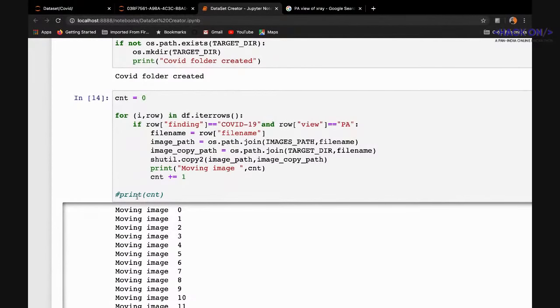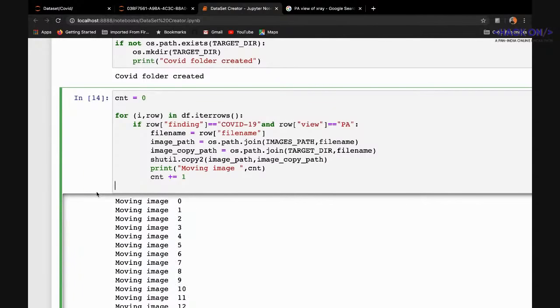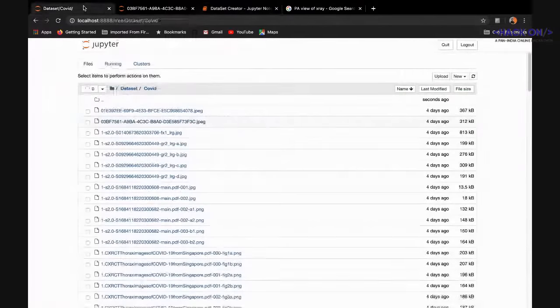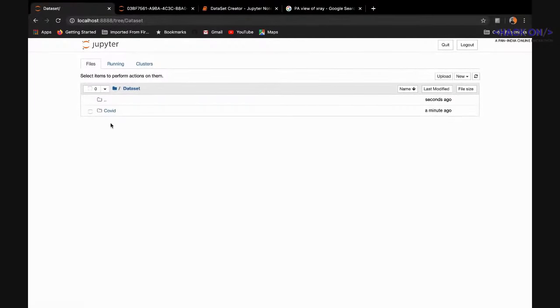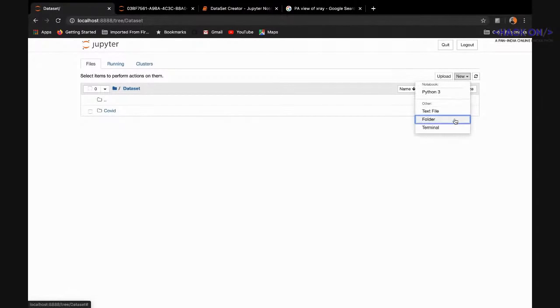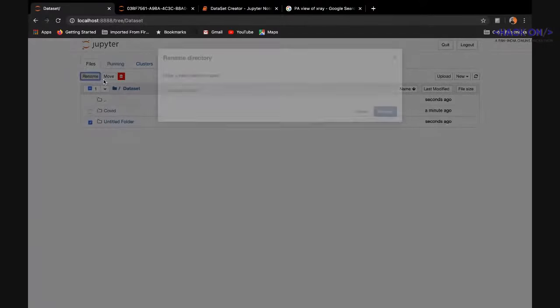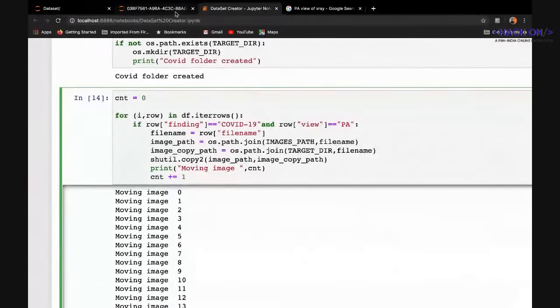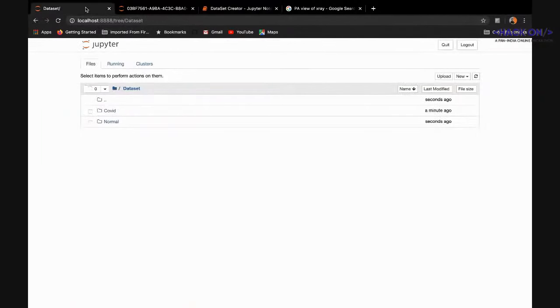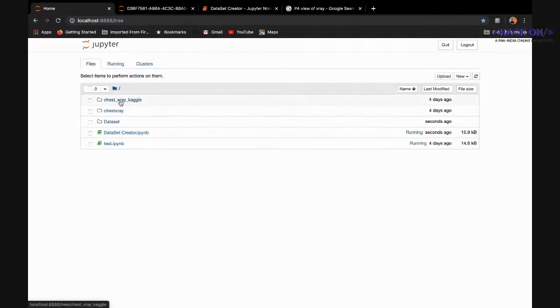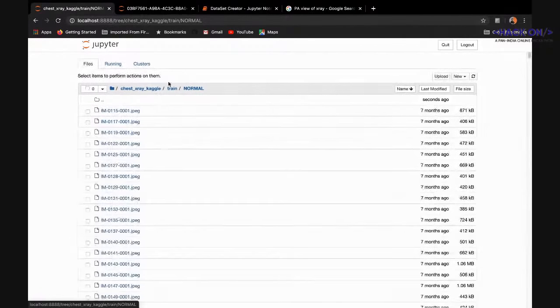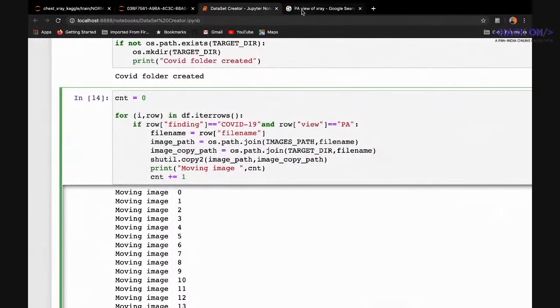Now we need to create a 'normal' folder. We'll create another folder containing normal images using the Kaggle chest X-ray dataset. In the training part of that dataset there are two folders: 'normal' and 'pneumonia'. We'll copy some images from the normal folder.